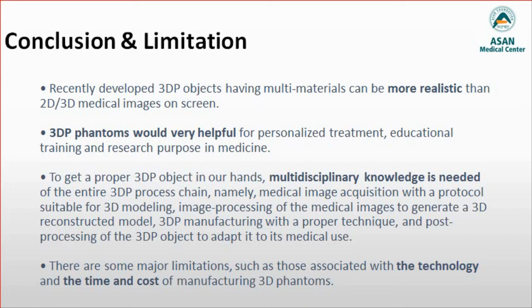Even though there has been a substantial increase in the number of 3DP medical applications, there are still some major limitations, such as those associated with the technology and the time and cost of manufacturing 3D phantoms. Development and optimization of the entire procedure, from image acquisition to 3D fabrication, are required for personalized treatment, even in emergency situations.